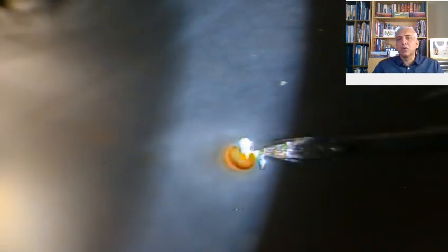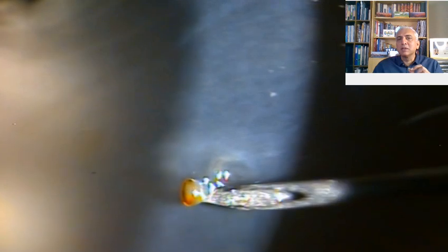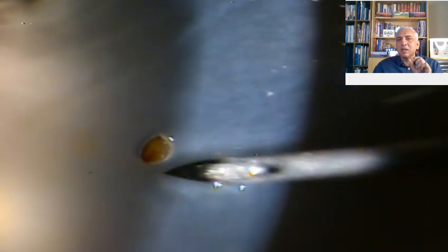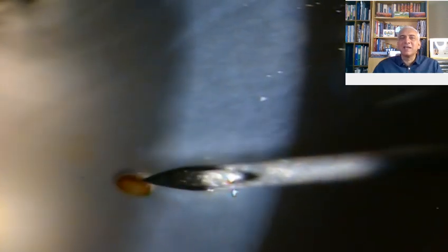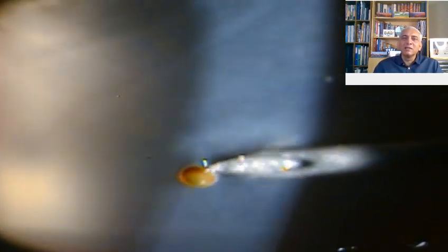There you can see I'm going behind that foreign body to get a clean removal. Once that is out, the next step is getting hold of that foreign body.